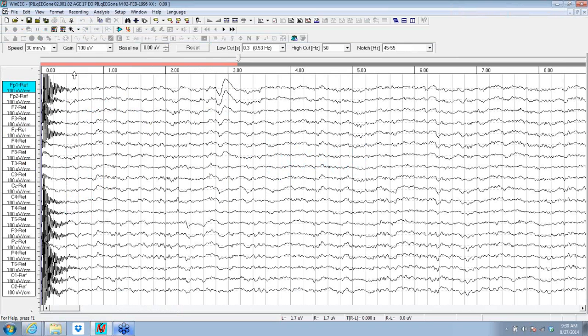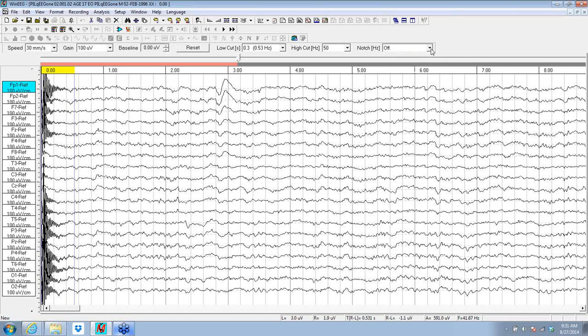At the beginning here, the amplifiers are just kicking in, and the filters are just kicking in as well. And right now, the European filtering here is the default. And if I put the 60 hertz filter on, it doesn't really change much of anything. This was probably recorded with a 60 hertz filter on, and we can't recover it by turning it off. That's an issue that's got to end up being addressed in the next version of the Discovery software.